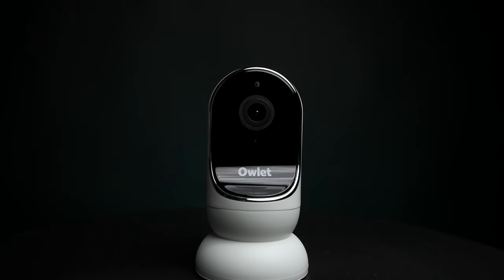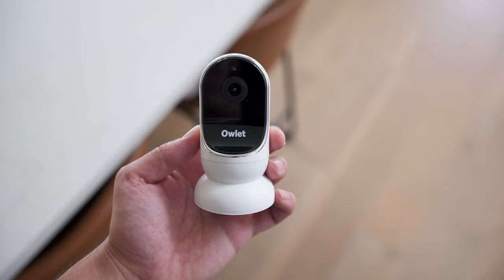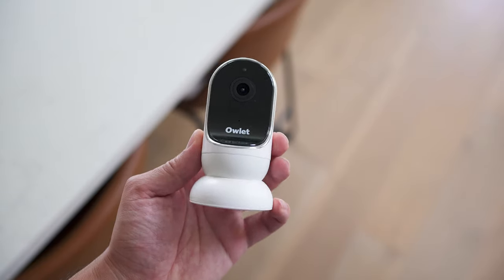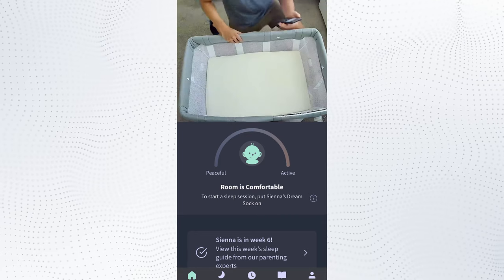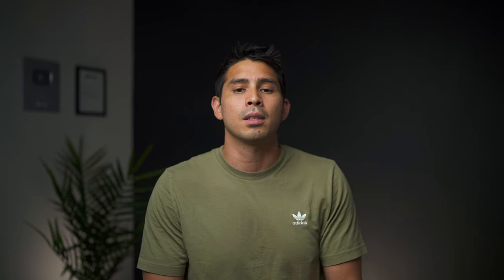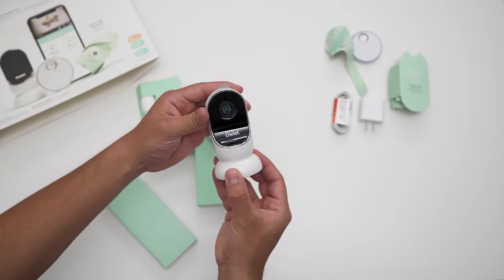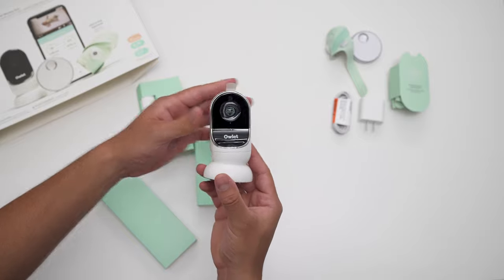While the sock is the star, Owlet does offer the connected monitor to see your baby as well. In the past, I hated it — I thought the connection was pretty bad — but on this go, I've actually been pretty happy with it. It's a fixed camera, seems to load fast, and delivers a decent image overall. It's not as clean as Cubo AI, but it's fine. It has two-way talk and you have the option to toggle background audio monitoring as well. Overall, surprisingly good.